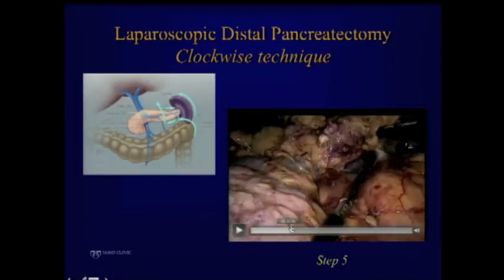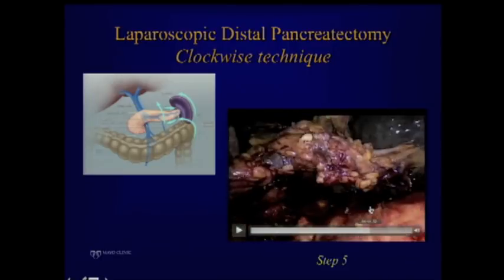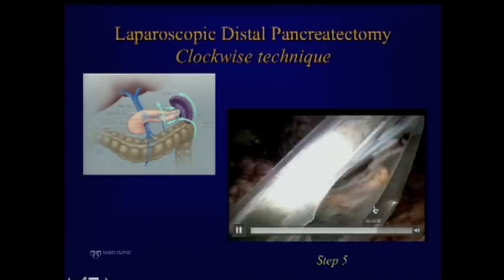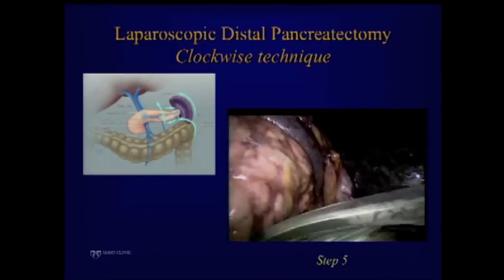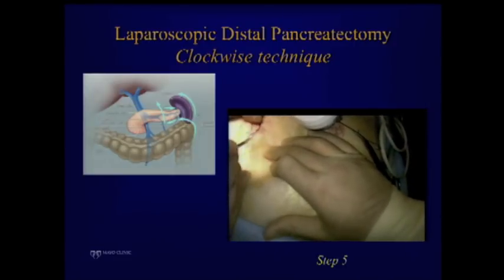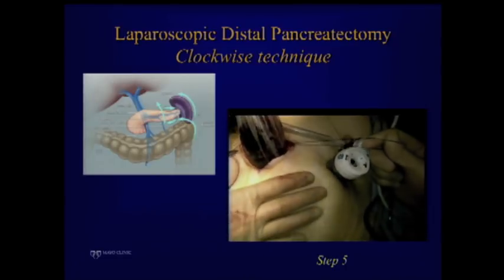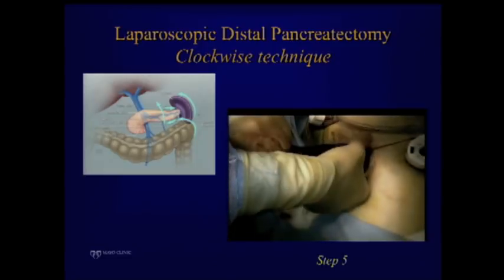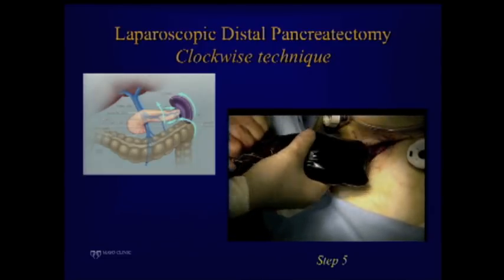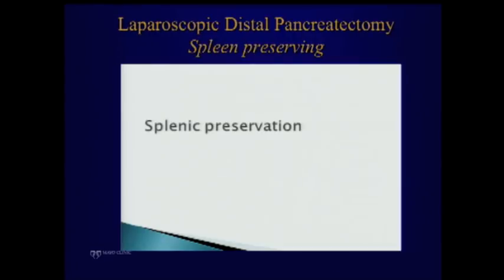The majority of the time we do a piecemeal morcellation inside a bag through the back of the spleen. Occasionally we do a slightly larger incision around the umbilicus, as in this case, to maneuver the specimen. People ask how you get the whole specimen out — it's really putting your hands around the back and you can just deliver it. This is a four-centimeter incision.